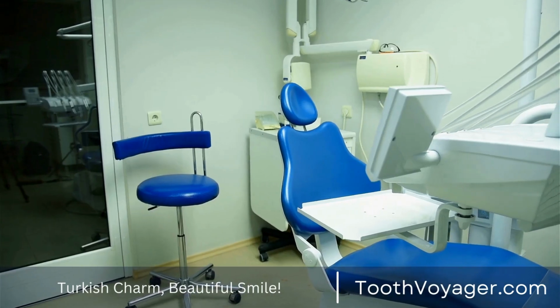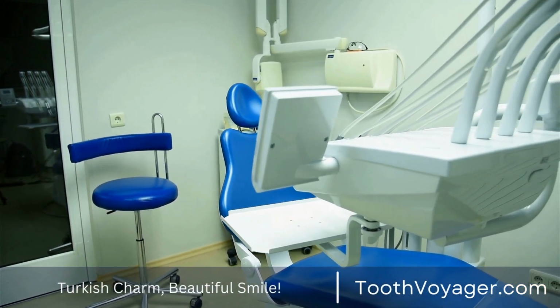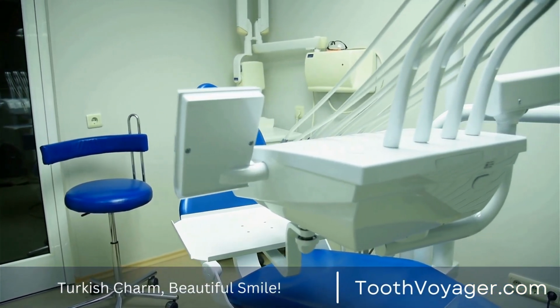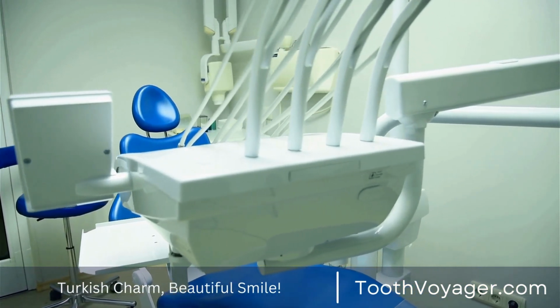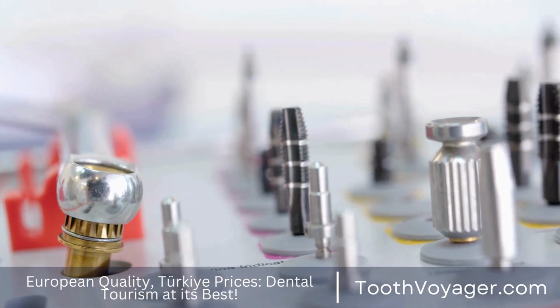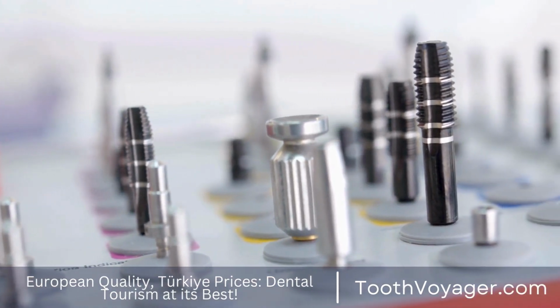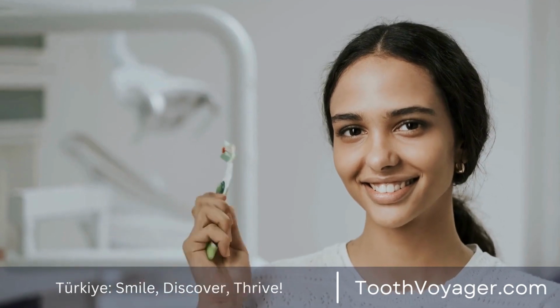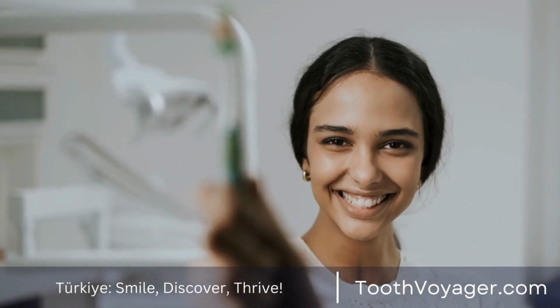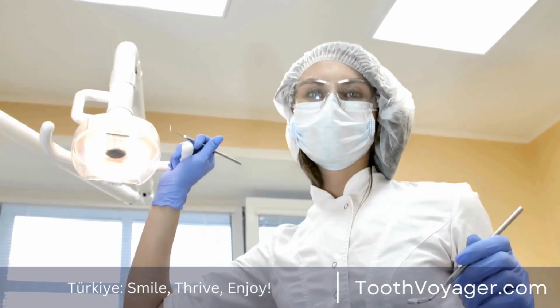Creating natural-looking replacement teeth. The process of designing natural-looking replacement teeth with dental prosthetics starts through an examination conducted by a dental professional to identify the ideal treatment strategy that is suitable for the person. When the plan of treatment is determined, impressions of the patient's mouth will be taken to form a mold, which is used to create artificial teeth. The mold for dentures is created to produce an image of wax dentures. This is taken to the dental laboratory for the fabrication.